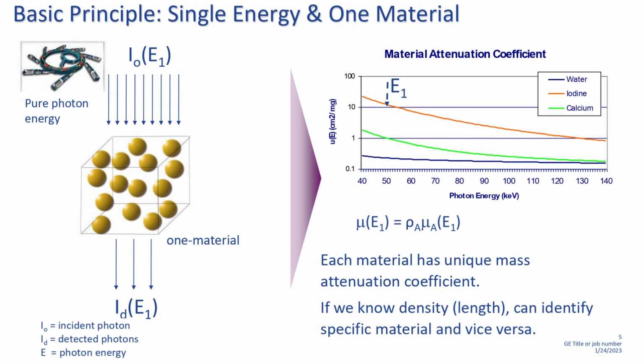So if you measure this, then easily you can say the attenuation of this material, that is mu, at energy 1 we can calculate. It's very easy. The attenuation is subdivided into two things: mass attenuation and density attenuation. Actually, when we studied, we only studied mu, right? Actually, the mu has two components, one because of density, second because of mass attenuation. That's the total attenuation. Put a known X-ray beam, you measure the X-ray beam after attenuation, and you can calculate what the attenuation is.